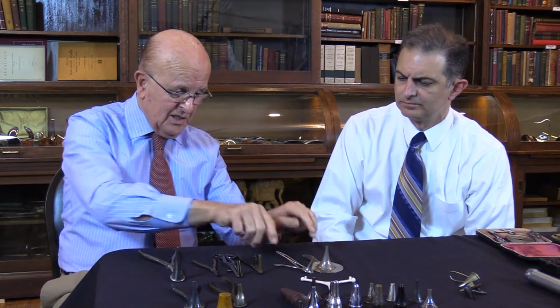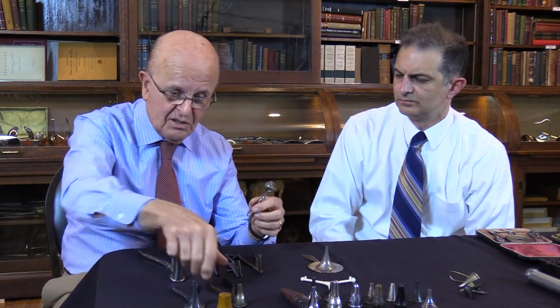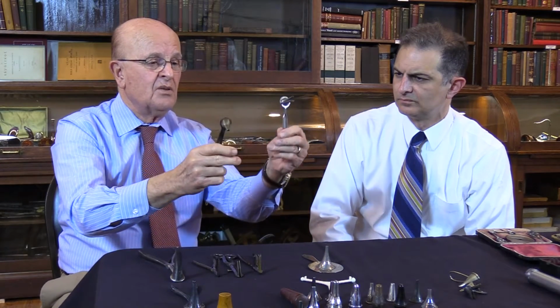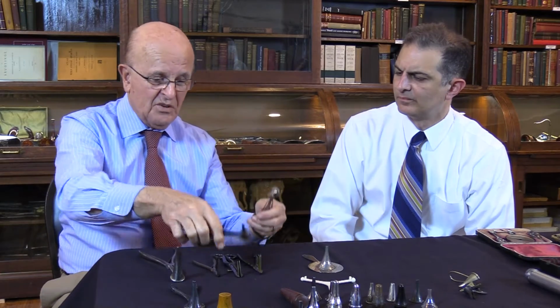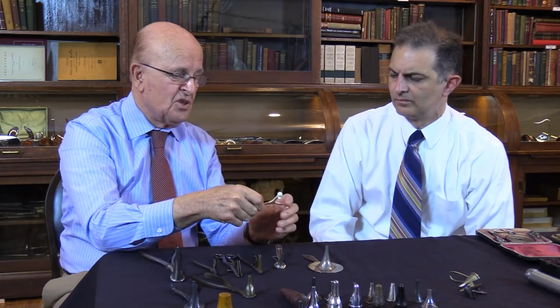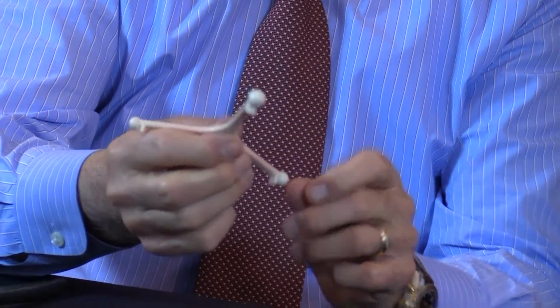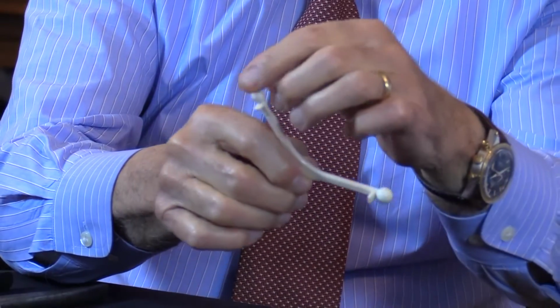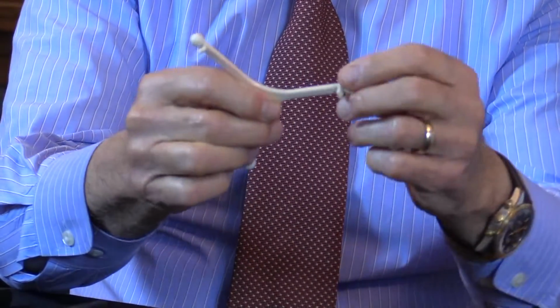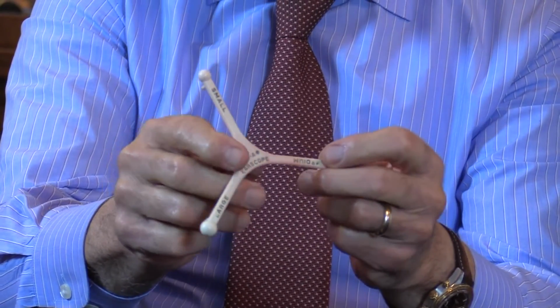Yeah. And somebody came up with something like this. So instead of squeezing it in this direction, you squeeze it front to back. Yeah. And it's a bivalve. But the interesting thing I've never seen, except for years looking for these things, this is called the ear scope. It has the gauge. So before the examiner chooses the ear speculum, they get the gauge large, small, and medium. Yeah. It's fascinating.